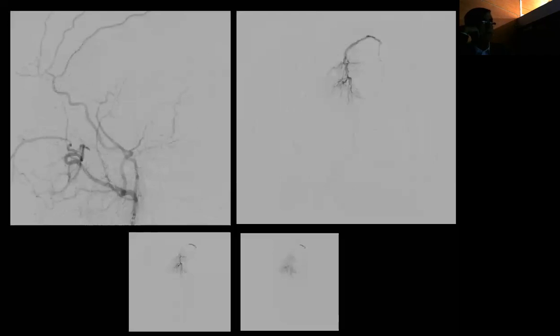This is in the process of embolization. We will select a branch, and we will go as close as possible to the tumoral bed itself, to the parenchyma. This is the parenchyma. All right. This diffuse stain is the parenchyma of the tumor. The tumor is right there. This is one compartment of the tumor.